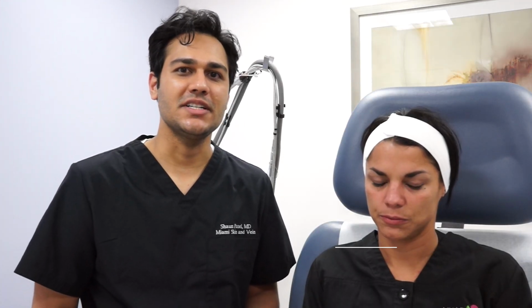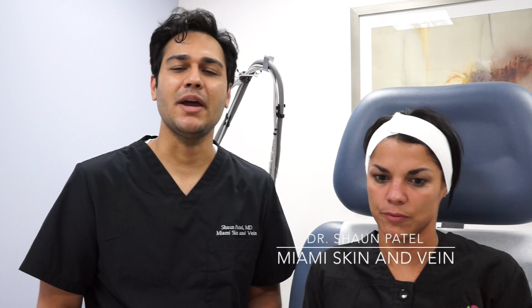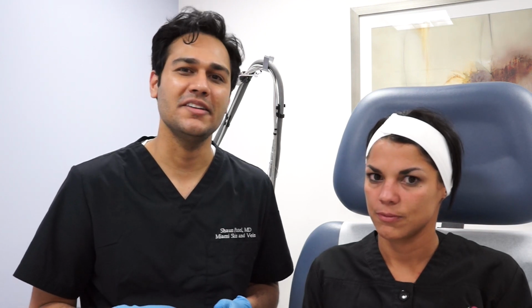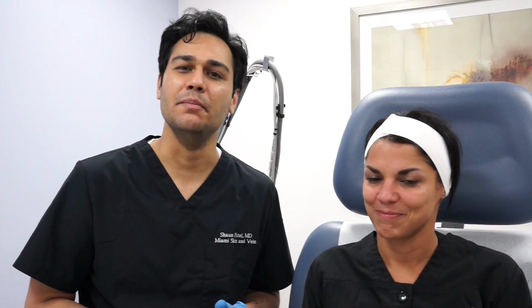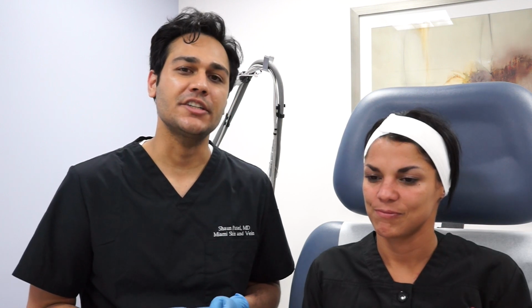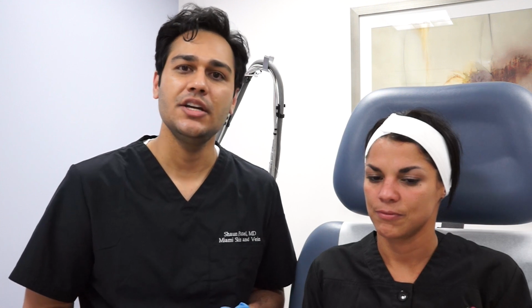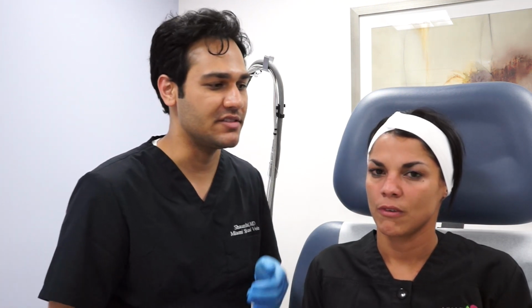My name is Dr. Shaun Patel, and I am a physician at Miami Skin and Vein in Coral Gables, Florida. Today we've got Iris from our staff to volunteer for a bunny line injection. I'm actually going to inject Botox into her bunny lines, her nasalis muscle, to correct bunny lines, a common problem that we see in many of our patients.